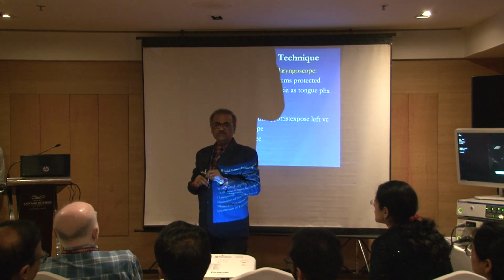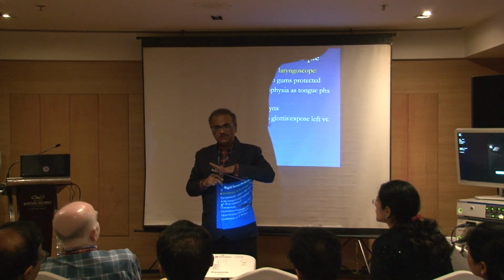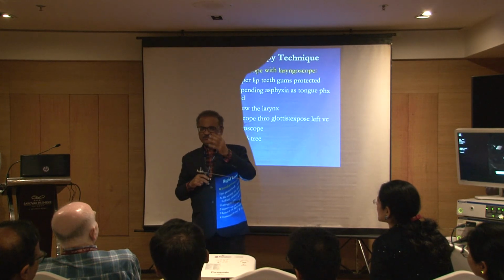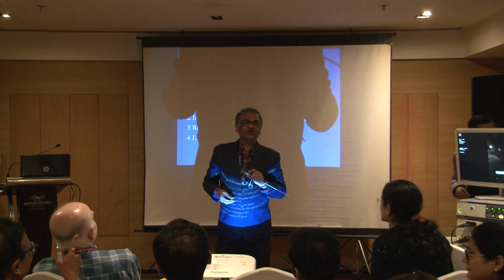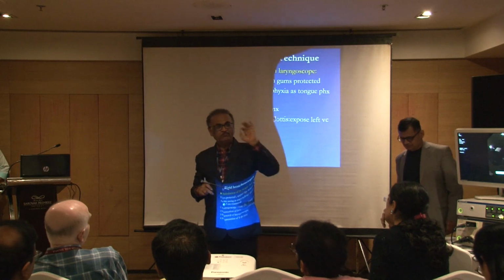What has happened is the limitation with this scope and forceps. Out of 10 cases, how many times will you use this and how many times will you use the collector? My answer will be straight. Yeah, 10 out of 10 times. No, this will be in your almari. Because convenience is now with what has happened. It is good for demonstrating, good for teaching, good for recording, good for presenting.